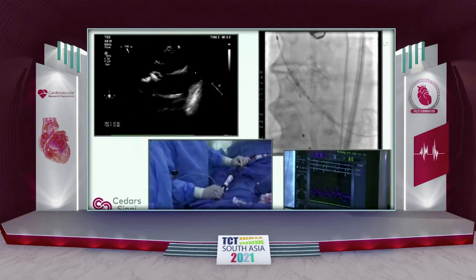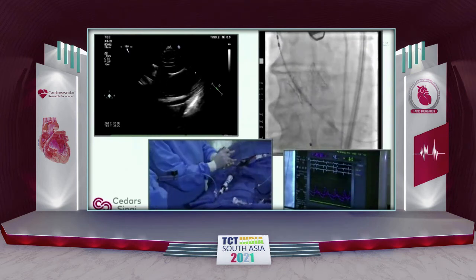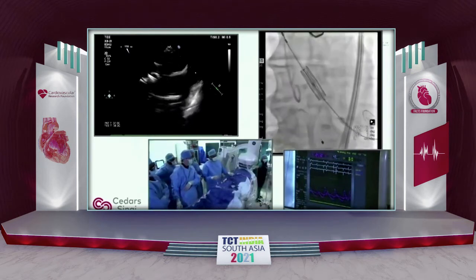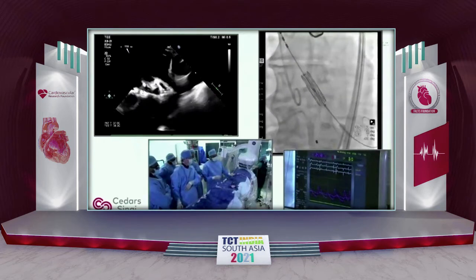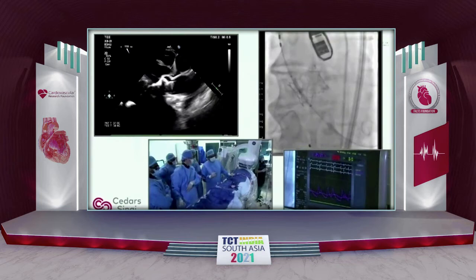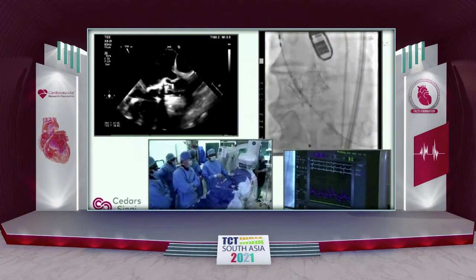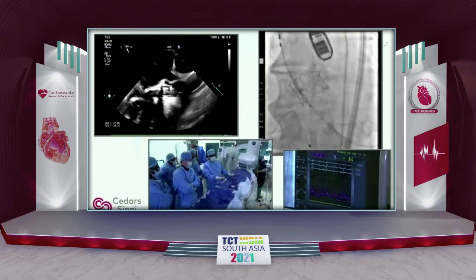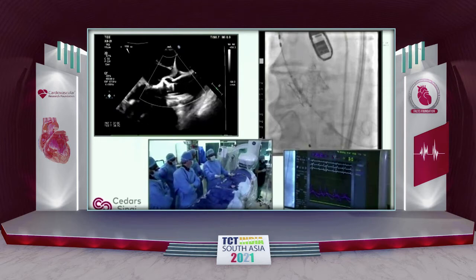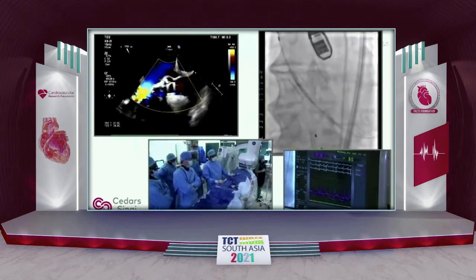So Raj, were you looking at the inflation gauge with the original deployment? Do you give some credence to the theory that if you've gone past 6 atmospheres or so in these LVOT calcium patients? Yes, we always look at it, and a lot of times they'll stop and not go beyond 7, and we will rather do another inflation. I think that will happen. Okay, so let's go ahead and do another one.